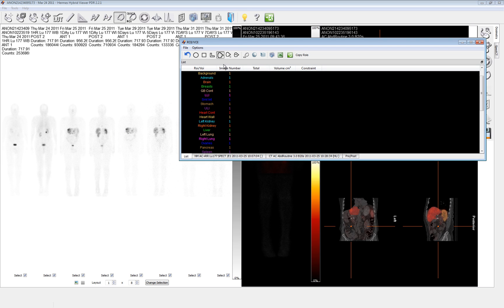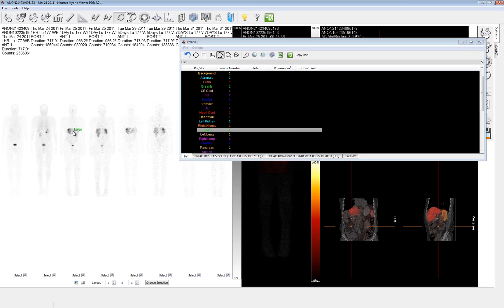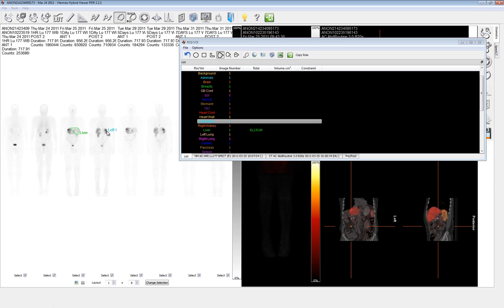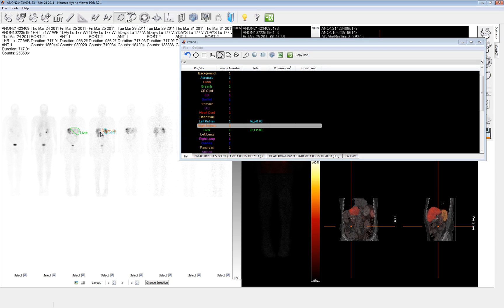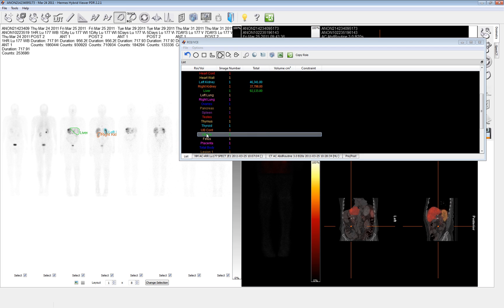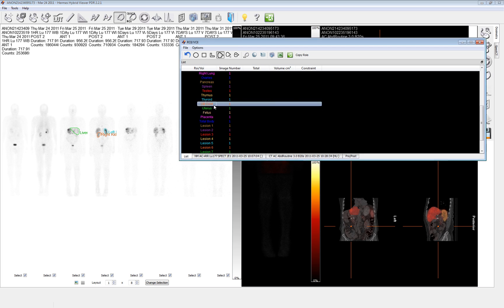So we go into the freehand option. We're going to define a few of the organs. Now one of the other things that's probably worth mentioning is that when we draw these different organs, it really doesn't matter which one of these images you draw anything on. You can move to do a liver in one and a kidney in the other and there's no problem with that. Switching between posterior and anterior views also does not create an issue. Time points do not either. The urinary bladder was not actually present inside of the original SPECT CT but it is available to us here in the whole body so we'll grab it and also include it.